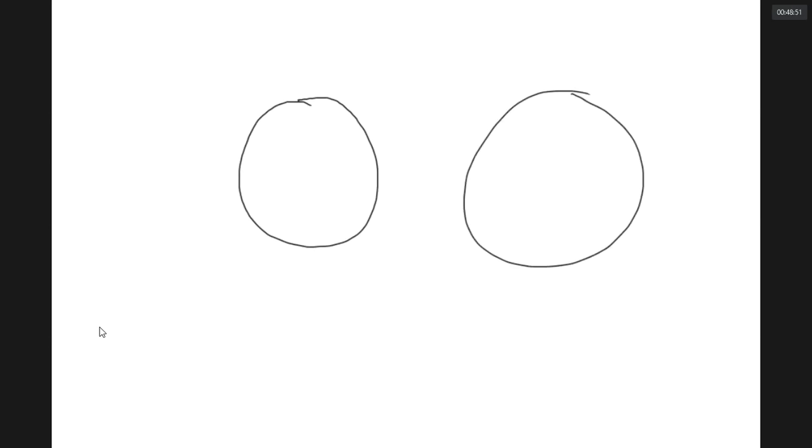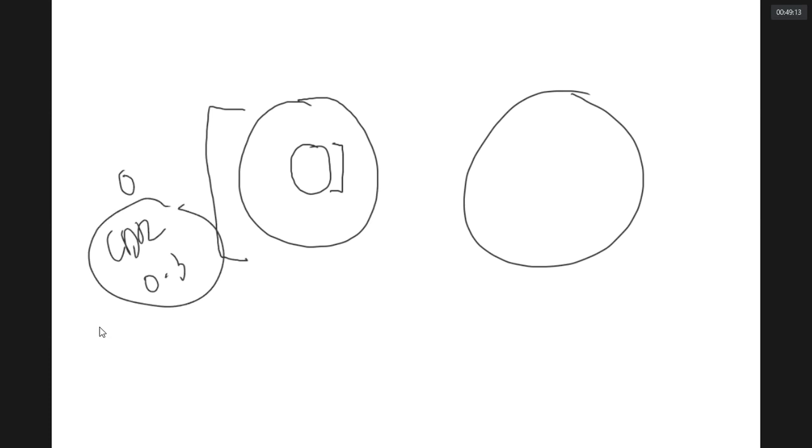If the CD ratio is not normal, then what should we draw, and using what color? Usually, for me personally, I just use black color. So let's say this is an optic disc. Okay. When we say that this is normal, usually this is how we draw. You can see that the vertical height of the cup in relation to the disc is what we call a CDR of about 0.3. It's not exactly, because the proper way you have to measure the vertical height of the disc, and then the cup.